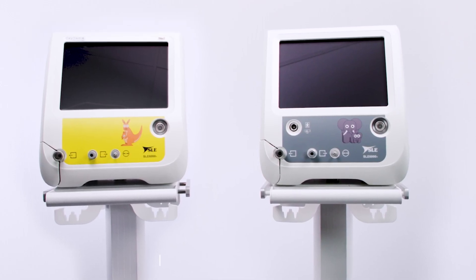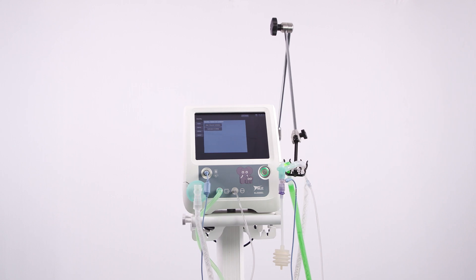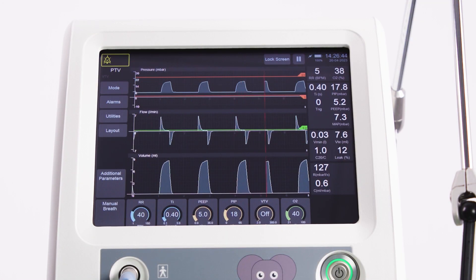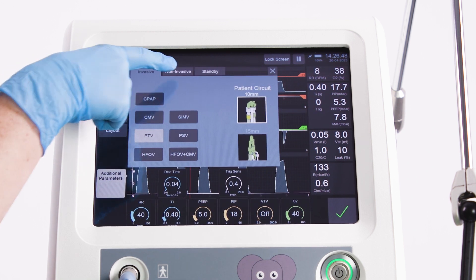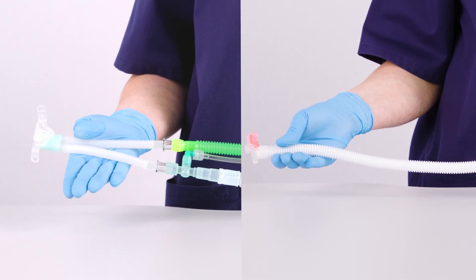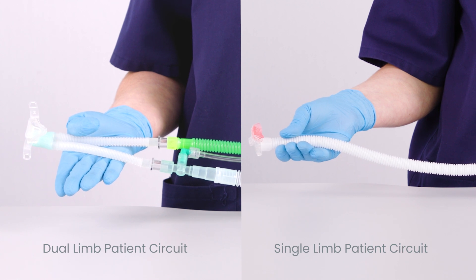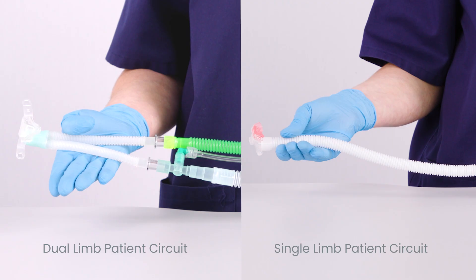Non-invasive ventilation connections on the SLE6000 range with the inter-surgical circuit. The SLE6000 can be used for non-invasive ventilation and high-flow oxygen therapy if these modules are installed on the ventilator. Non-invasive ventilation on the SLE6000 can be applied using dual-limb or single-limb patient circuit configurations depending on the user's preference or clinical scenario.